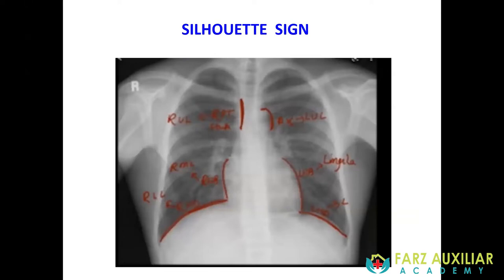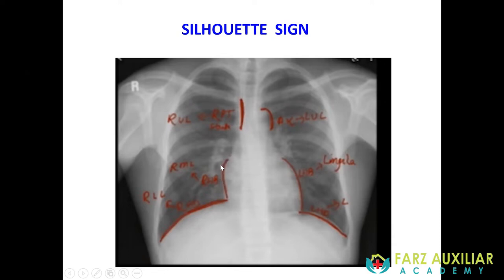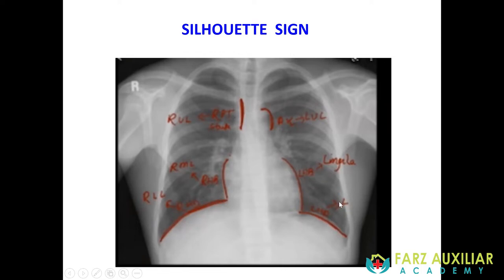Now, something called the silhouette sign is very helpful to localize a lesion. The mediastinum is white and the lungs are black. If there is a white consolidation adjacent to a white structure, that border disappears. When the right heart border disappears, that indicates right middle lobe pathology. When the right hemidiaphragm disappears, it indicates right lower lobe pathology. When the aortic knuckle cannot be seen, it is left upper lobe pathology. Left heart border disappearance indicates lingula, and left hemidiaphragm disappearance indicates left lower lobe pathology.